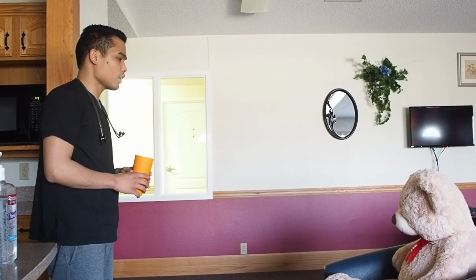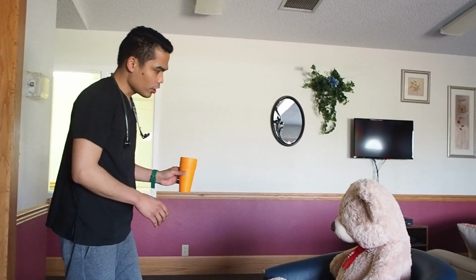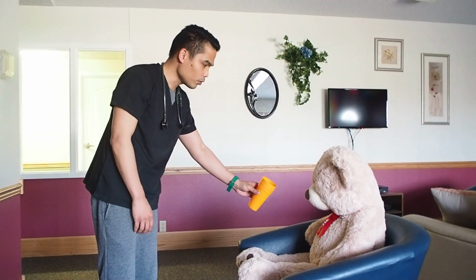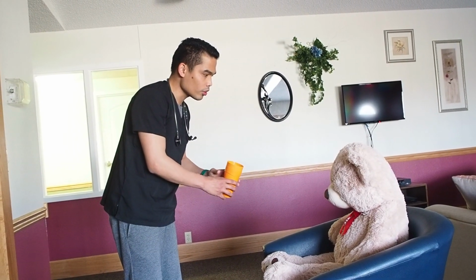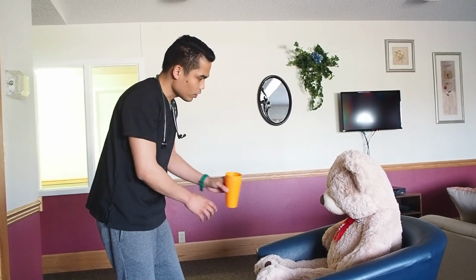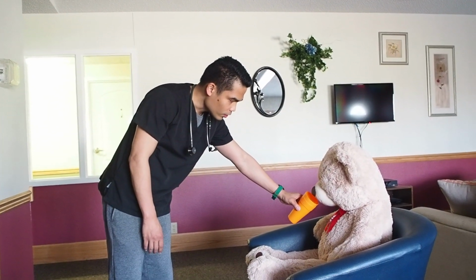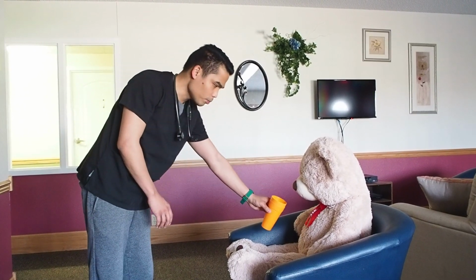Okay. By the way, this medication contains a corticosteroid, so to prevent some side effects such as oral thrush, we're going to give you a glass of water. All you have to do is rinse. Do not swallow the water. All you have to do is gargle inside, rinse your mouth, and spit it out. So here's the glass of water. Okay, gargle and spit it out.